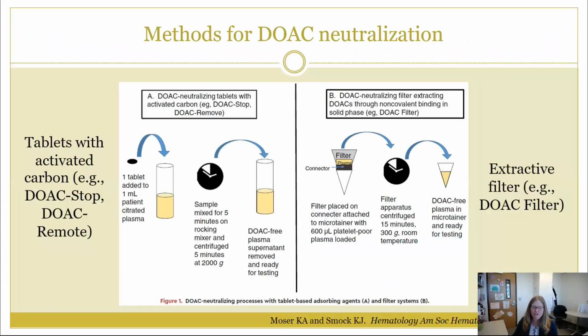And there are a few different approaches that are available for DOAC neutralization. I'm showing them here on the screen. On the left, there are DOAC neutralizing tablets that have activated carbon in them, that when you incubate these tablets with your patient sample, they will absorb the DOAC. A couple of examples of these products are called DOAC Stop or DOAC Remove.